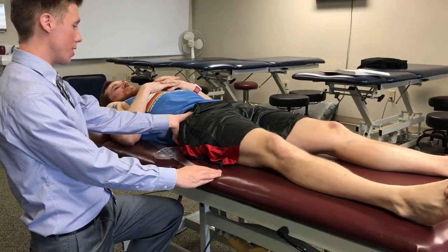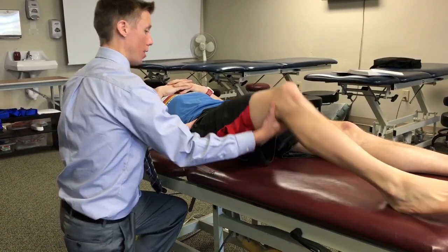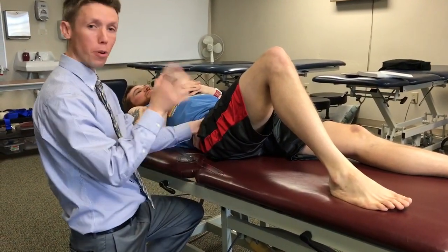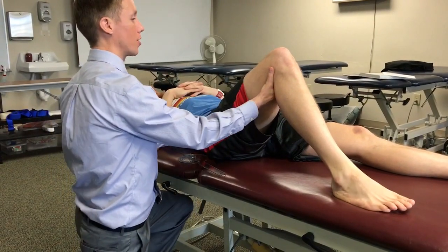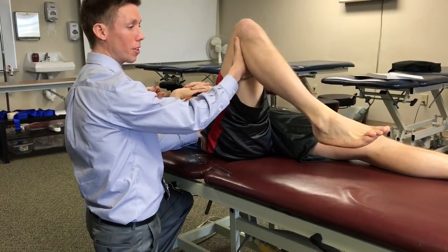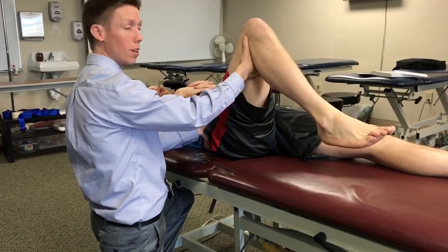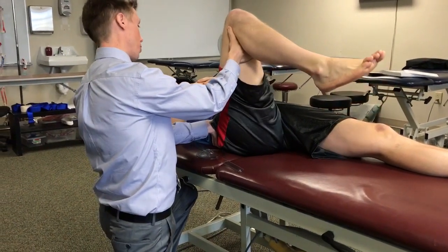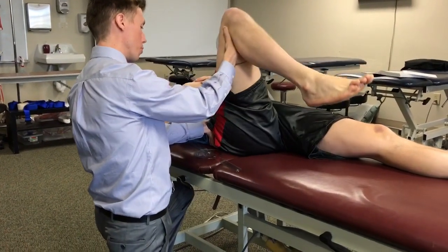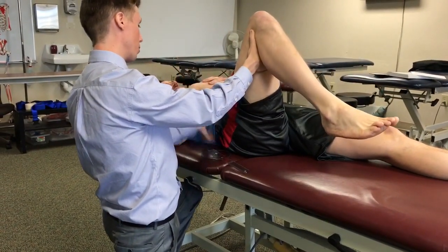We'll start with hip goniometry and hip flexion range of motion. For this one it's important to first palpate the pelvis to see when it posteriorly rotates when we take him into hip flexion. This can be done active assistively, passively if your patient's small enough, or actively. So first I'll have him help me take him up and I feel the point at which his innominate starts to posteriorly rotate.